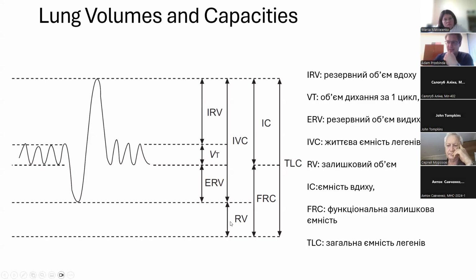So if they have a residual volume that's like 175% of what's normal, then they may benefit from that procedure. There's more to do there.